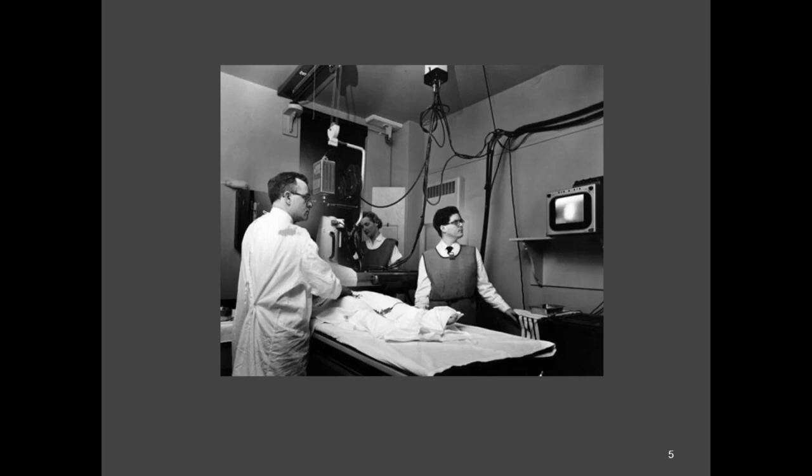The other thing that's interesting to see is all the special wiring and modifications they did to this. Again, I don't think OSHA or the Joint Commission would sanction any of that, but this is in the very beginning, so it's a learn-as-you-go thing. This came out about the late 1950s to give you a time reference.